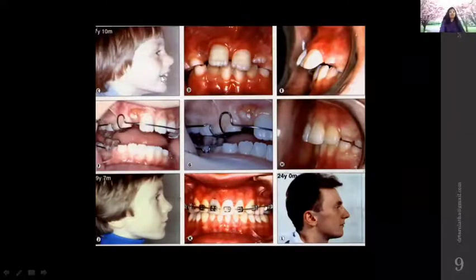It was giving undue labial force on these two incisors. When it was giving labial force on these two incisors, this force led to the resorption in the re-implanted area. Because of that, they came up with an appliance which could position the mandible forward so that the lip trapping was reduced. So thus were developed the blocks, the two blocks here, and the mandible was brought forward, and there was no problem of the lip trap, and the tooth was pretty much stabilized.